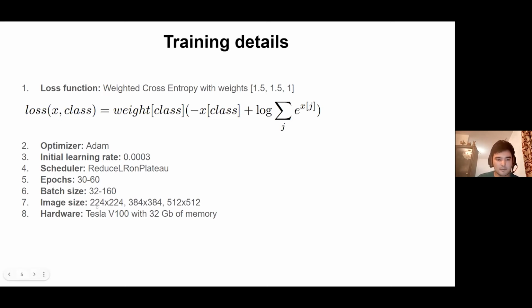The larger models I trained with smaller image sizes, and the smaller ones with larger image sizes. It also helps the ensemble learning since, if there are some opacities that are small, probably the larger image sizes will capture them better.